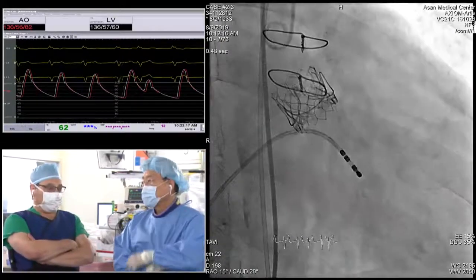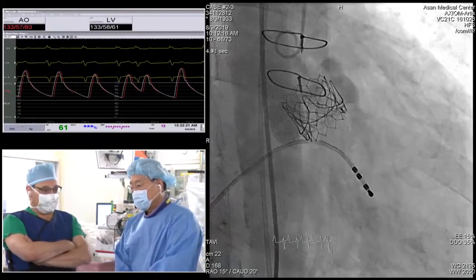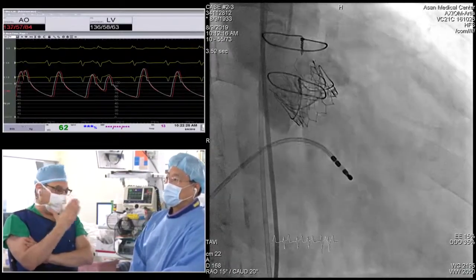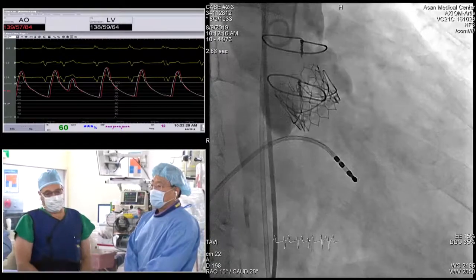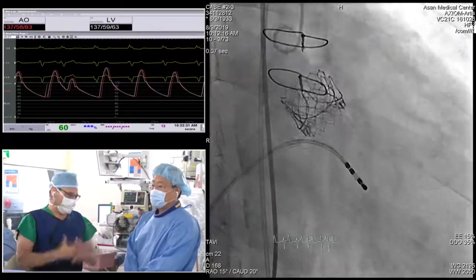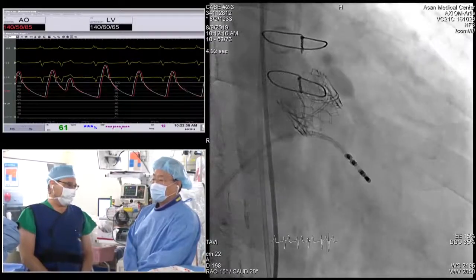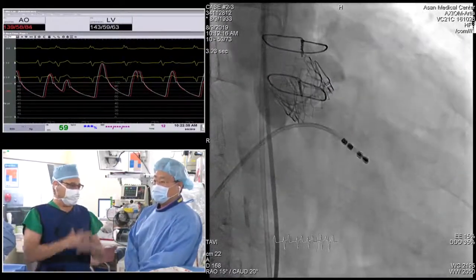I would say first, for sure, the smaller the valve, the more likelihood you're going to have an unacceptable gradient and feel like you need to do something to fracture it. Again, the dividing point, at least in the United States, seems to be around 20. If the true ID of the valve is less than 20, then there's a high likelihood you'll want to fracture it. In this case, this is a 23 surgical valve with a 21 ID, so it would be very unlikely we would need to fracture. But I think that is true.